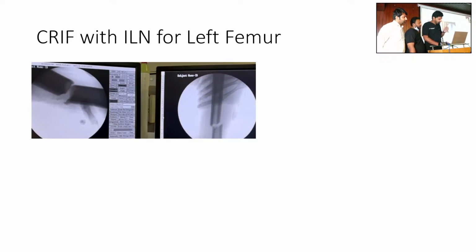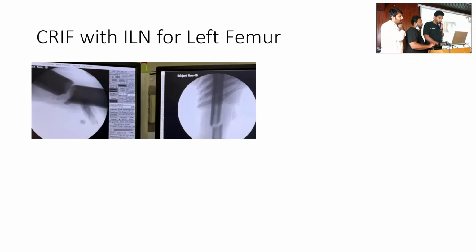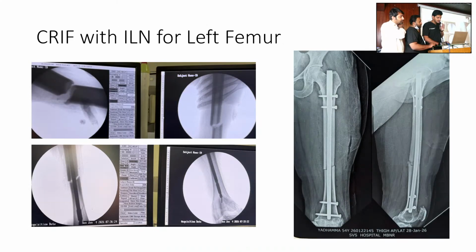You want to make her walk? Next day, can she walk? She can walk, sir. In this case, we put her on non-weight bearing. The fixation is stable, no? It can be done, sir. We put a size 9 nail, sir.